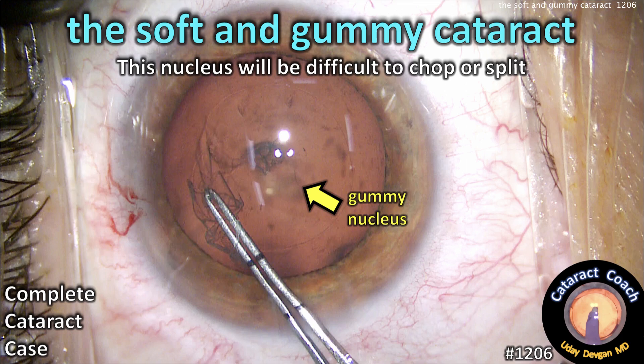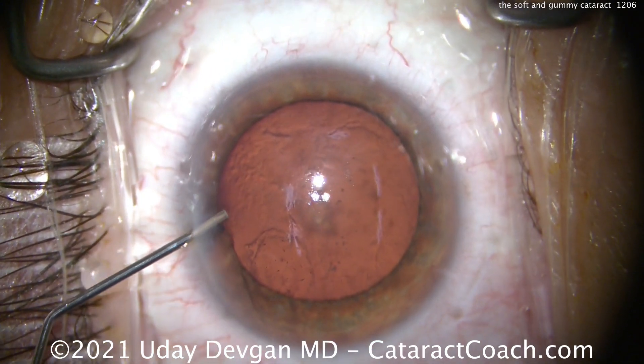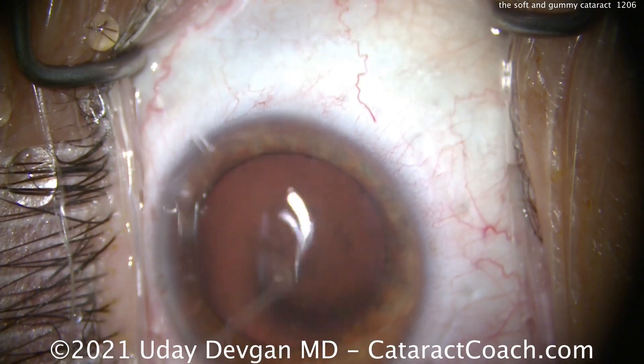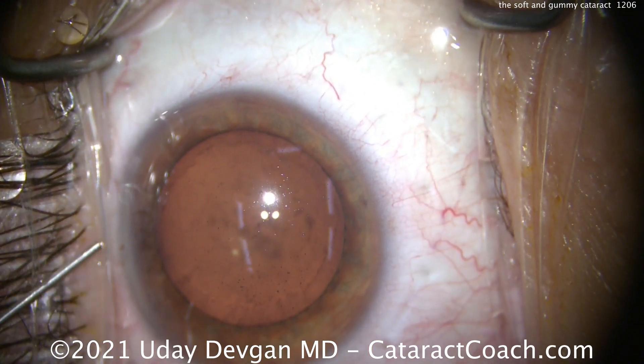CataractCoach.com — the soft and gummy cataract. This is the type of nucleus that's difficult to chop or split. We're going to show you the complete cataract case. This is not one of my most efficient cases, but I'm going to show you the whole thing unedited because there's a lot to learn from it.